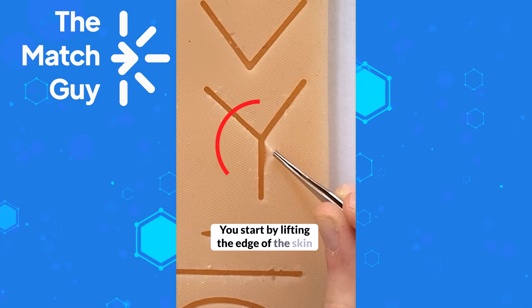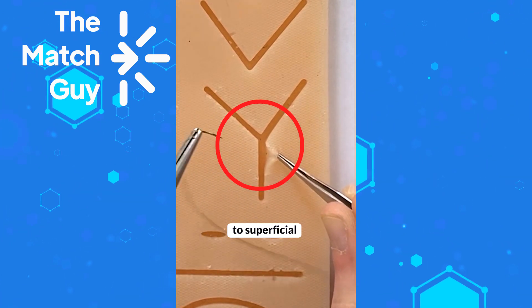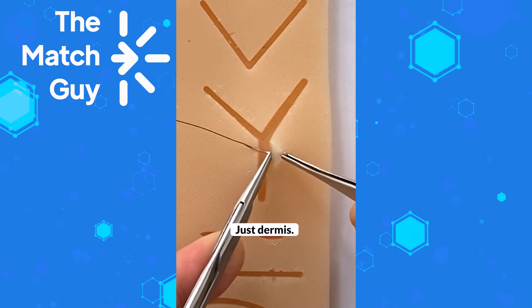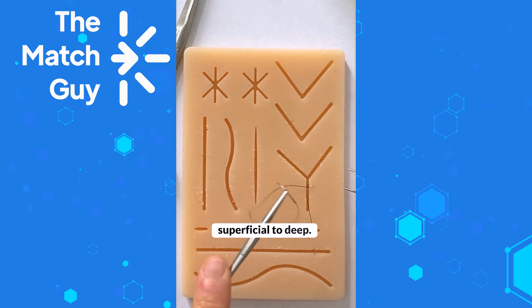You start by lifting the edge of the skin — make sure you don't crush the skin when doing that. Then you go deep to superficial. Again, deep to superficial, mainly grabbing dermis. Don't grab fat and don't go through the skin — just dermis. Then you pull and load your needle.